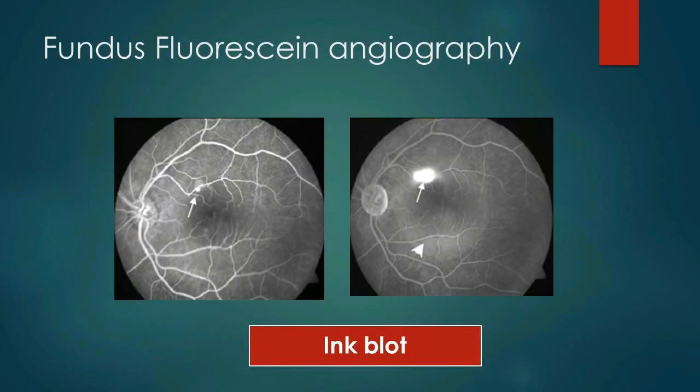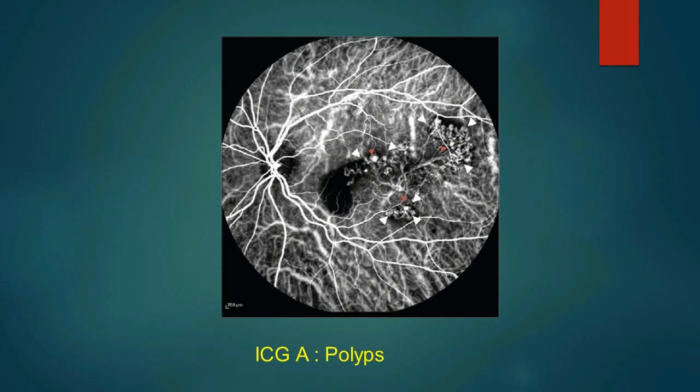Fundus fluorescein angiography is helpful to detect leakages, like ink-blot leakage in CSR. ICG angiography is mostly useful for choroidal vascular lesions — here we can see hotspots of idiopathic polypoidal choroidal vasculopathy.